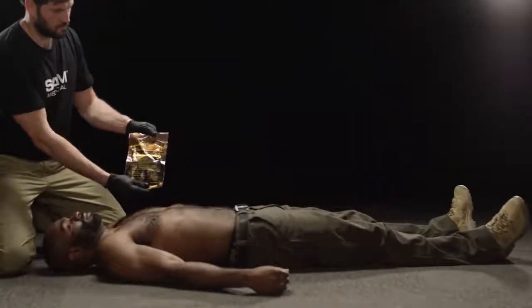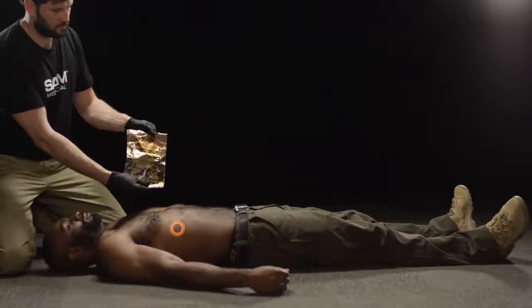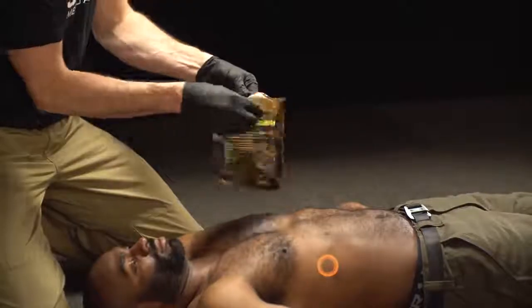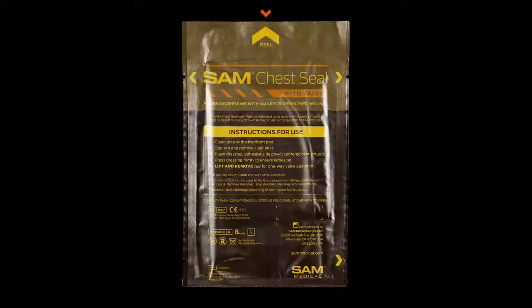Locate the wound. Remove the patient's clothes and run your fingers on the chest and back of the patient to ensure you have located all wounds. Quickly and easily open the sterilized SAM Chest Seal packaging by peeling it from tabs or tearing along the chevron-marked notches.